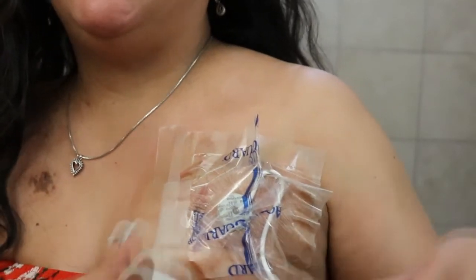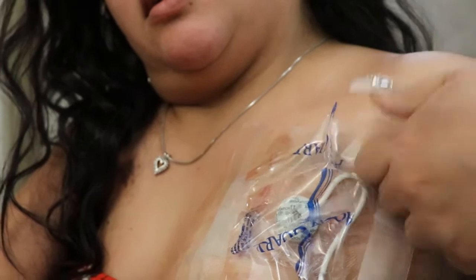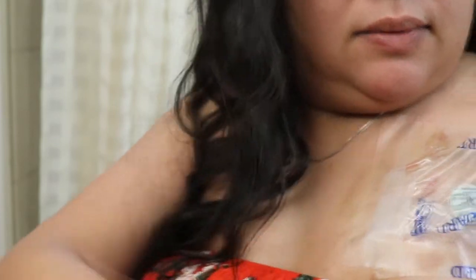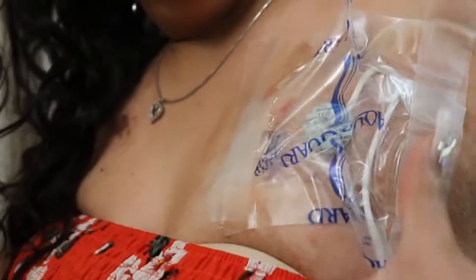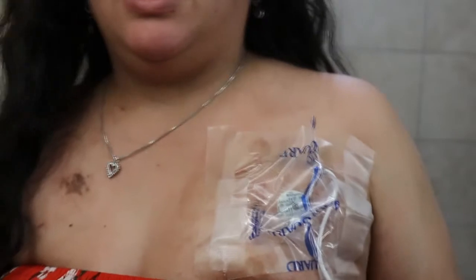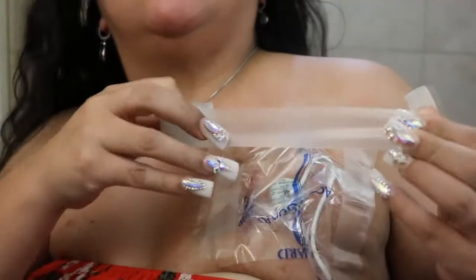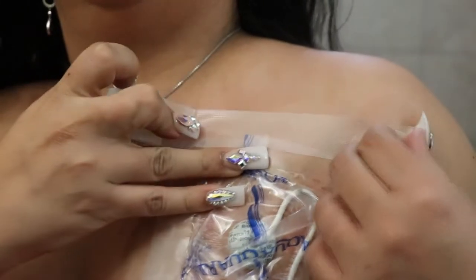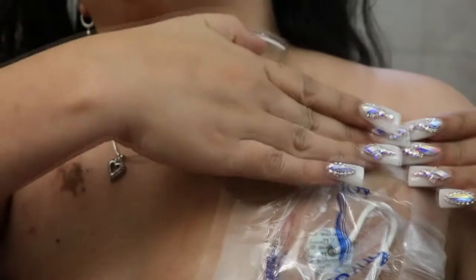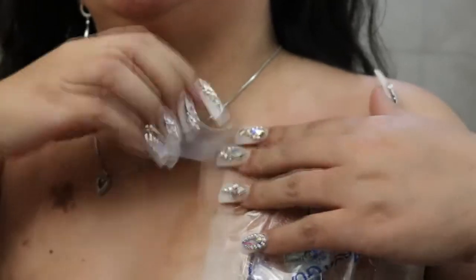Okay, so now do the other side from the top and push it down onto the skin. I can't see. And now, since the water falls down, you're gonna cover the top too, straight across. Super firm. See if there's a bend or a tear or a little fold, the water will get in there.